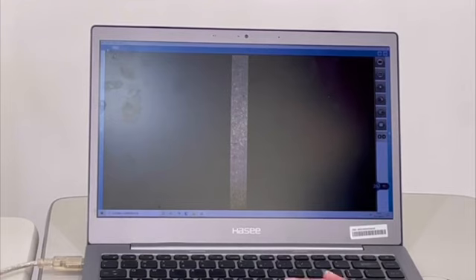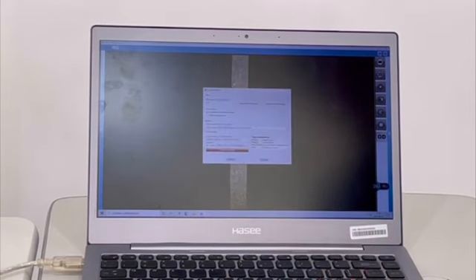On the top left, there is the doctor name. You can edit the doctor name here. On the top right, there is the configuration. You can set the recording time here as long as you want, and the default time is 20 seconds.